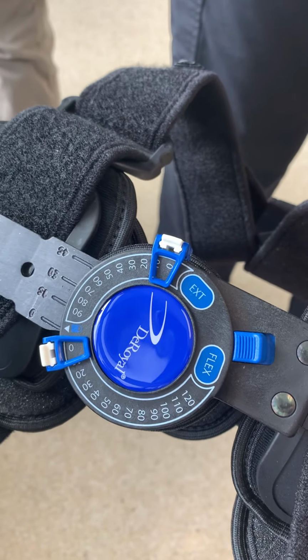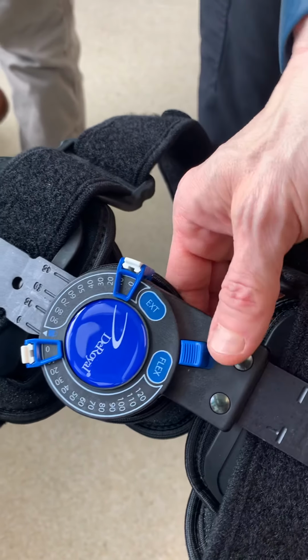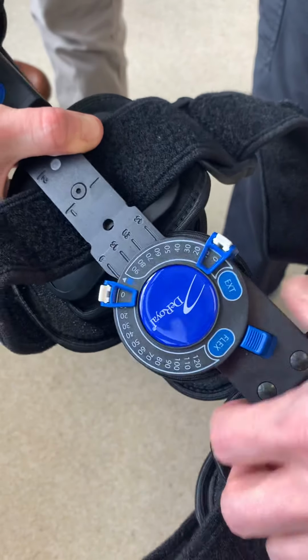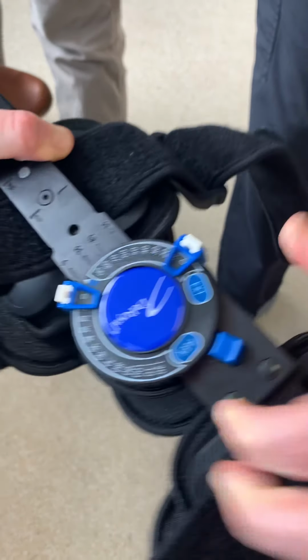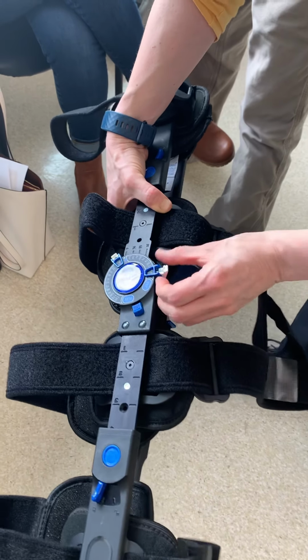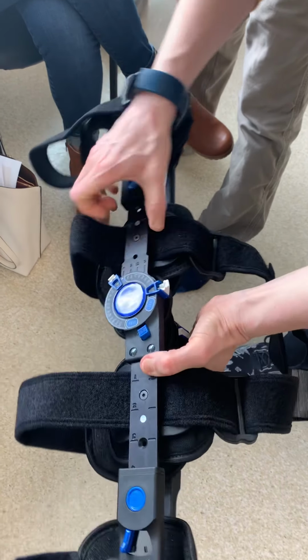Okay, how do we do that? This little guy here, there's a little switch that you have to, this is always the part I have to mess with a little bit. You have to really pull it quite a bit to get that to undo. Then that allows you to unlock and change the settings.